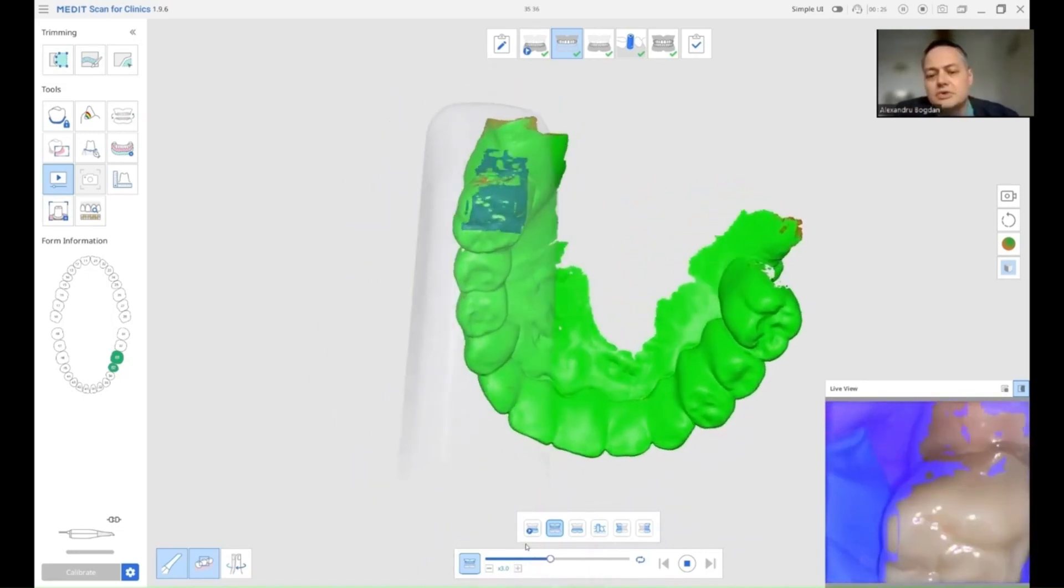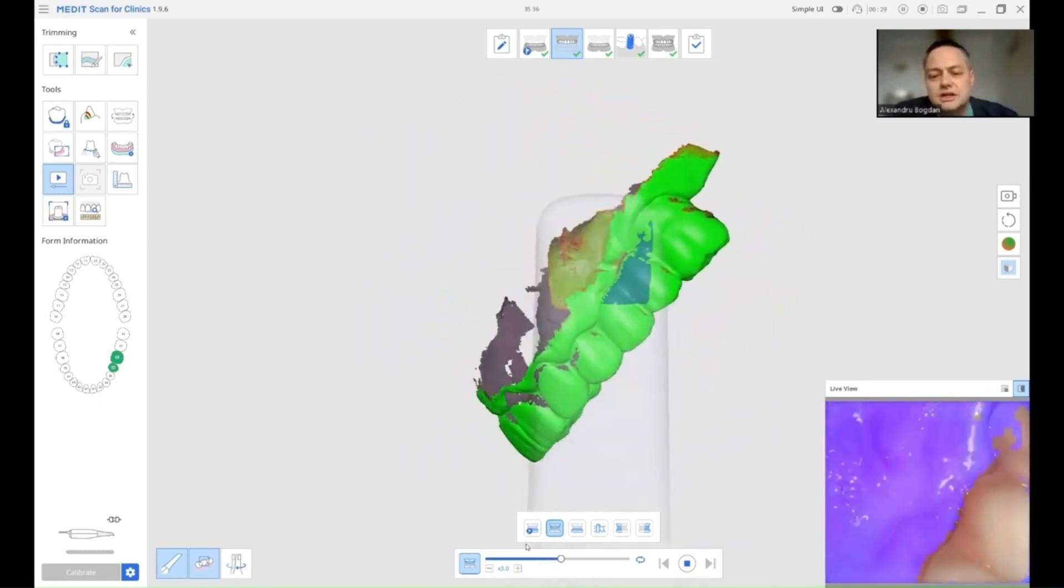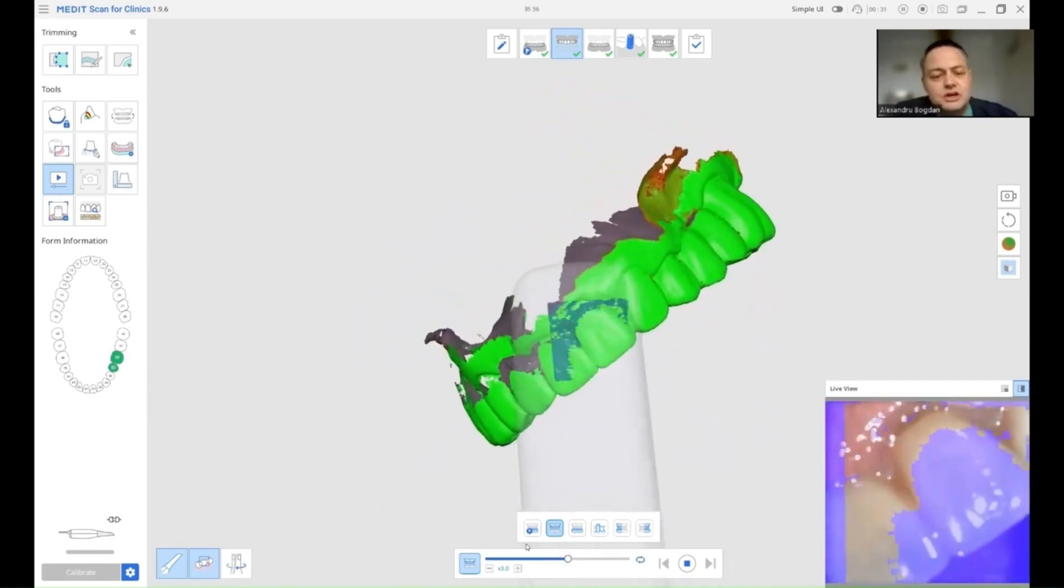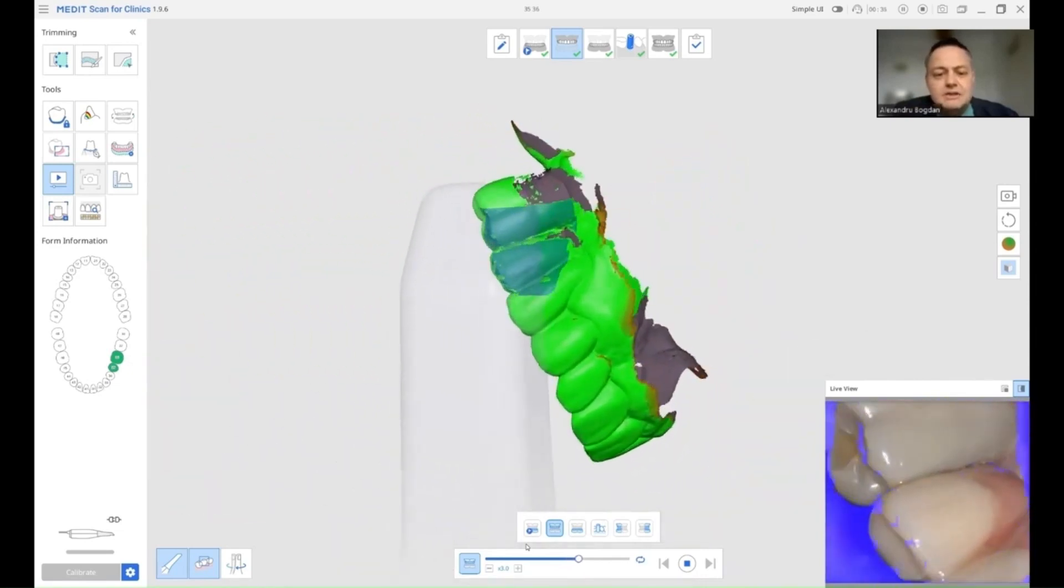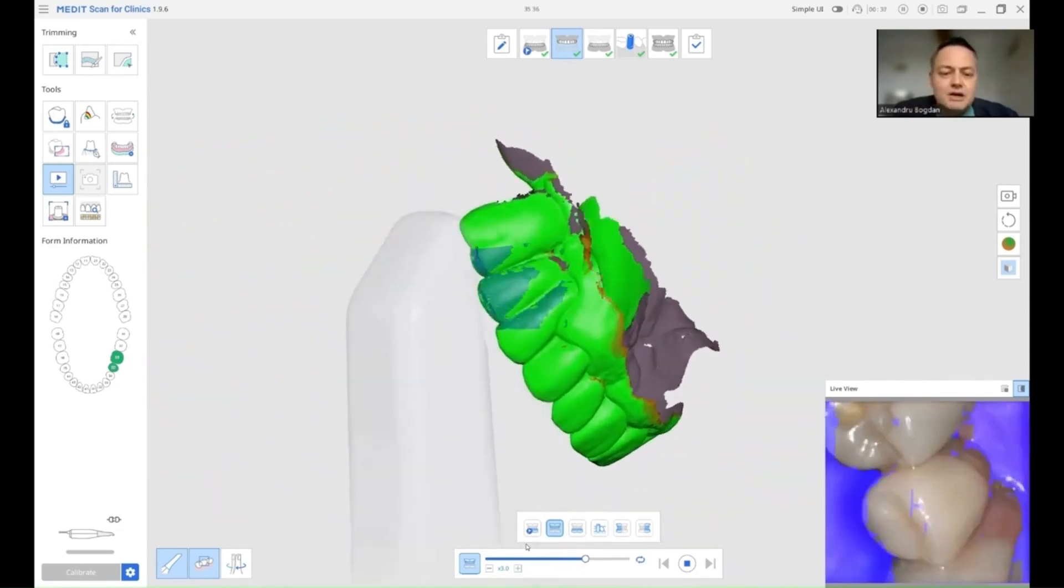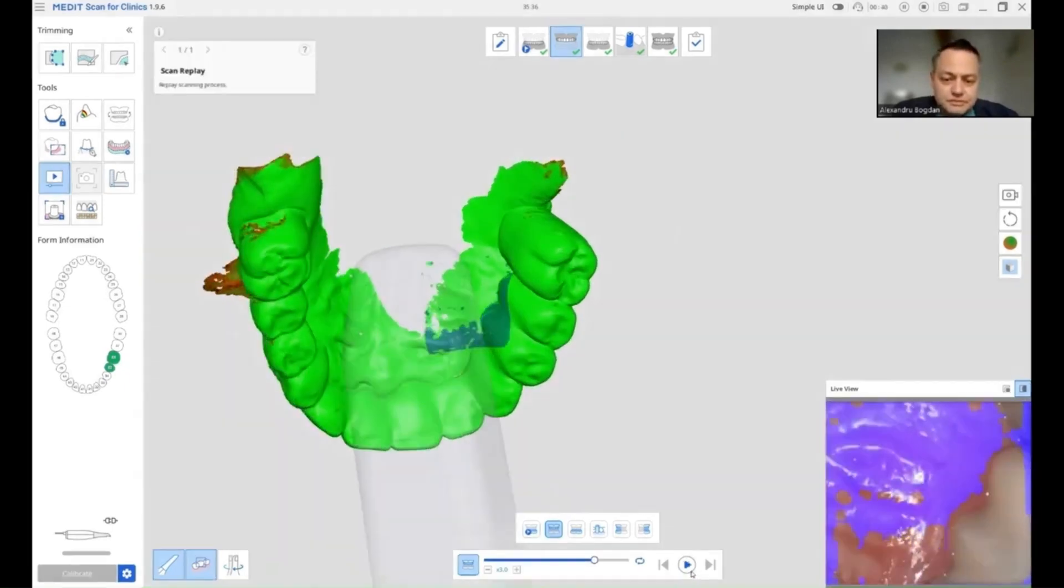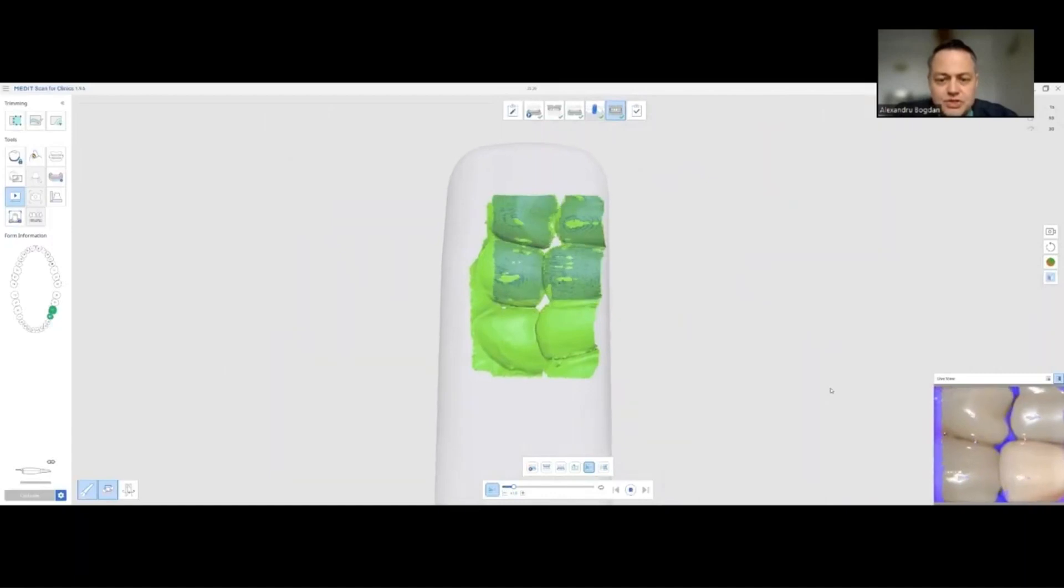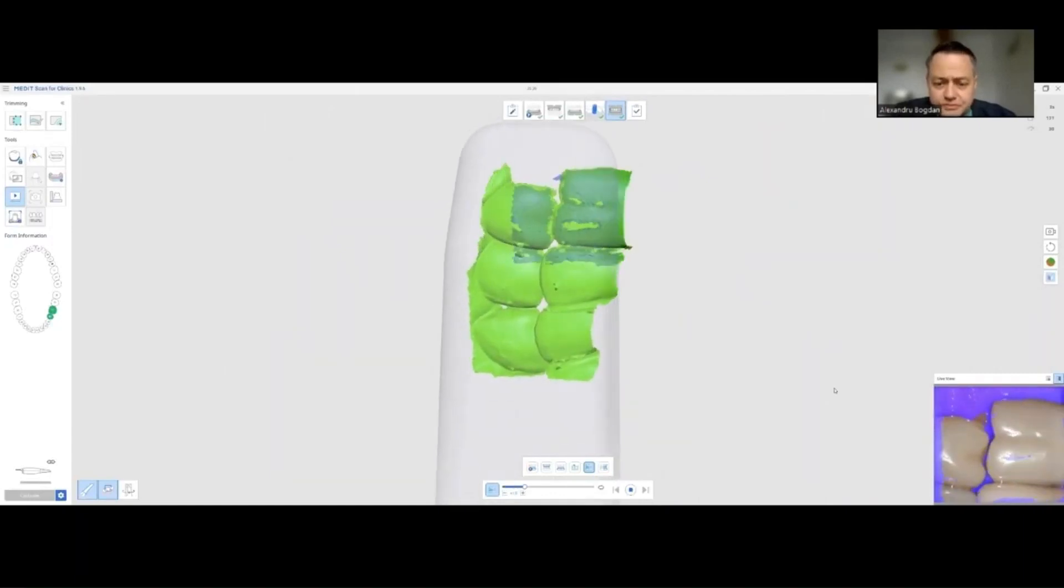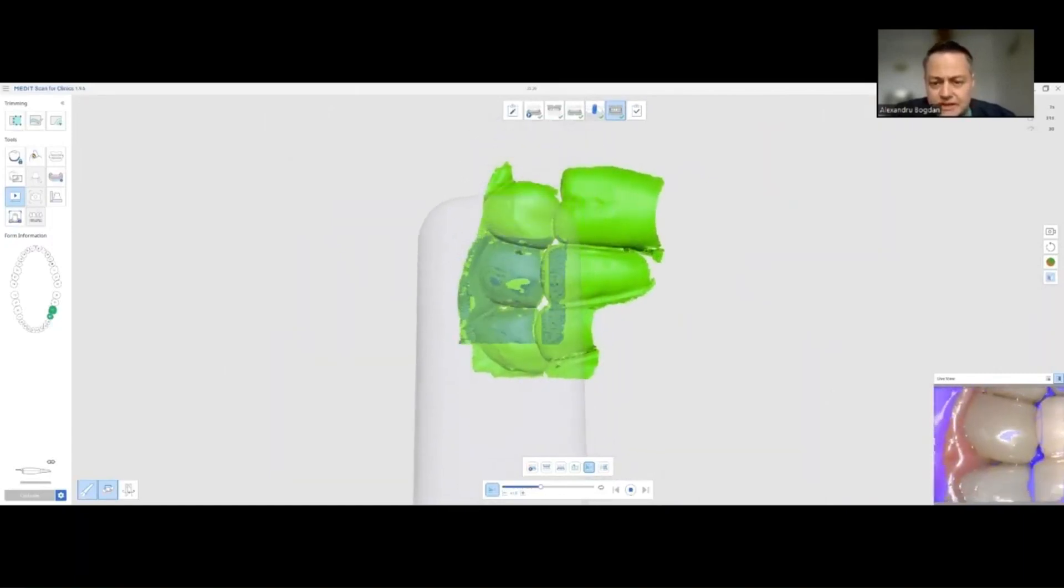Going to the lateral side, I am going to finish the palatal scanning and go on the buccal, add data there. We try to have as clean a mesh as possible, starting with the occlusion scans. We are going to then stop scanning. We need the scanner to optimize its data.